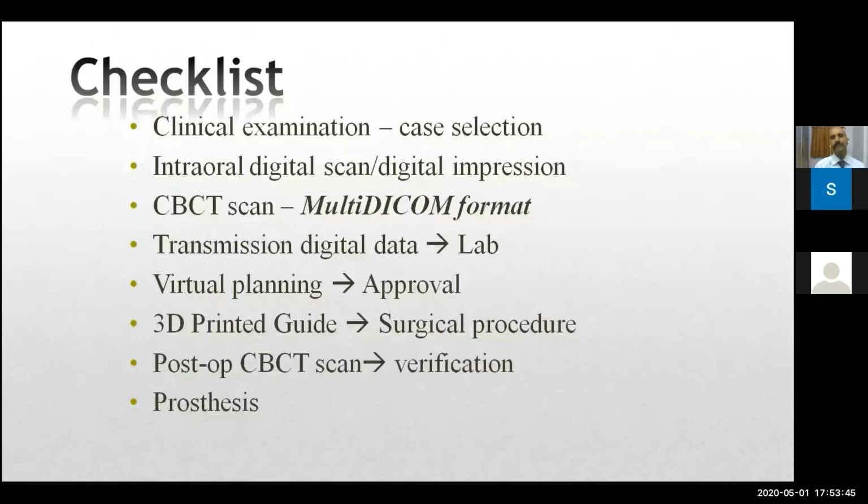Now for the CBCT scan, it's preferable that you inform the CBCT scan center that this is for a guided surgery, and the preferred format has to be multi-DICOM format. The DICOM format is a standardized format, and the output from a CBCT machine can be in a multi-DICOM format.